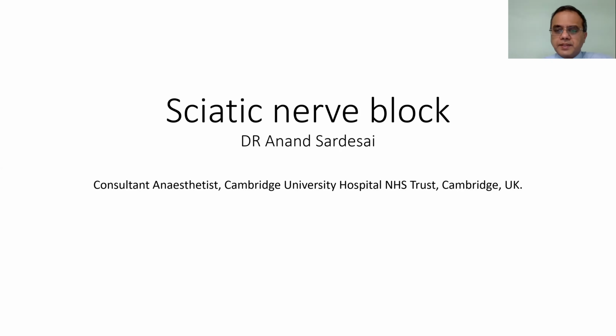And my job today is to tell you how we can use ultrasound to block sciatic nerve.